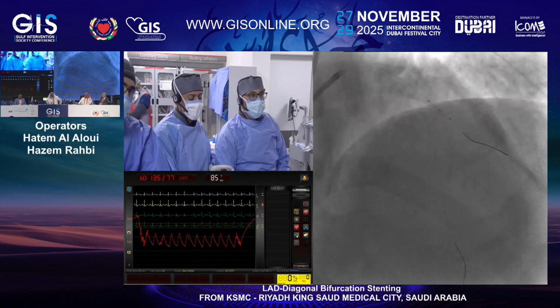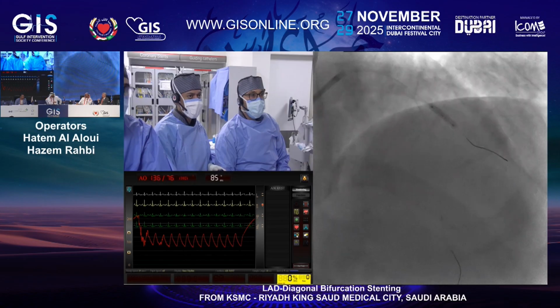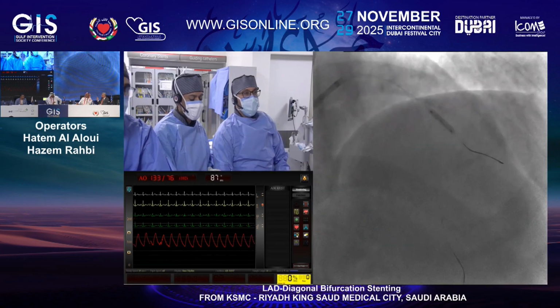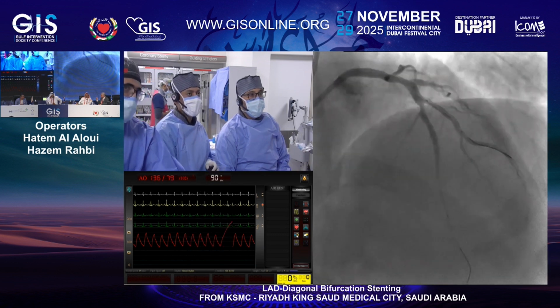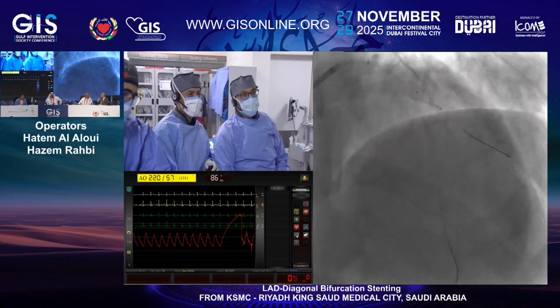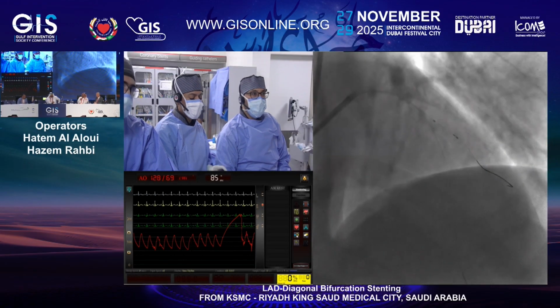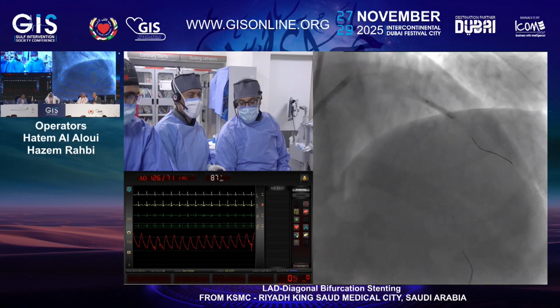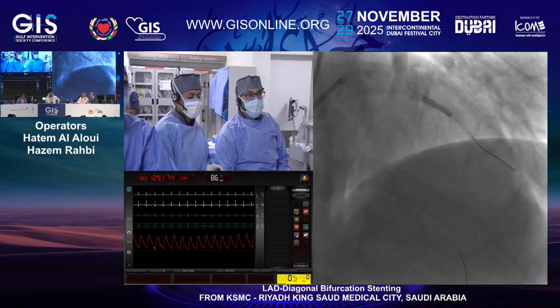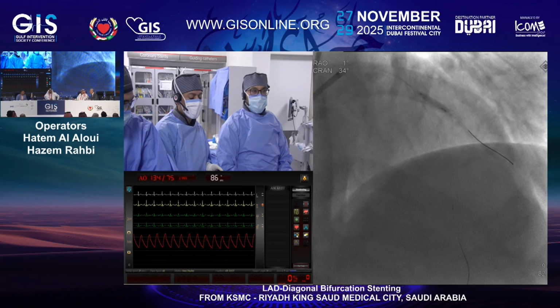One thing that we're not used to when you have a bifurcation lesion like this is to focus on the diagonal first before even tackling the main vessel. Usually what we do, we focus on the main vessel and see what happens in the side branch, and then treat the side branch later on. But here we do see a different approach. I agree. I think that with the DCB strategy, crossing through the struts with a DCB, you may affect the efficacy of the DCB.